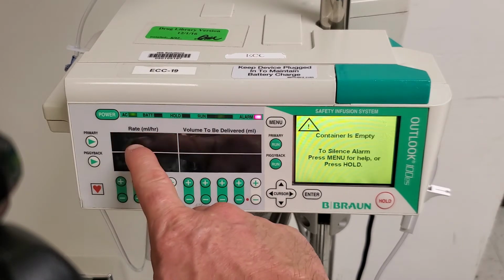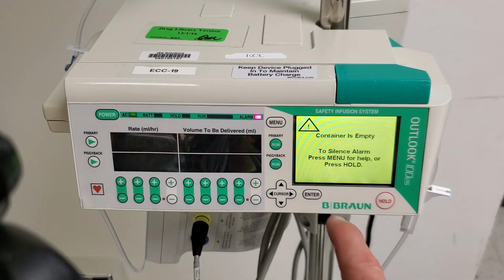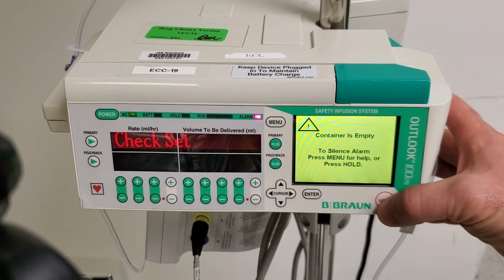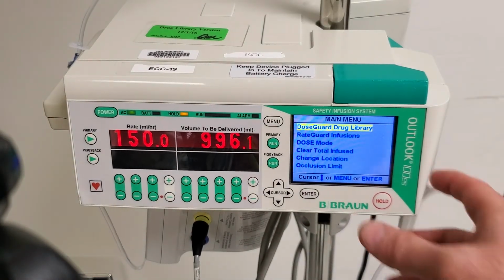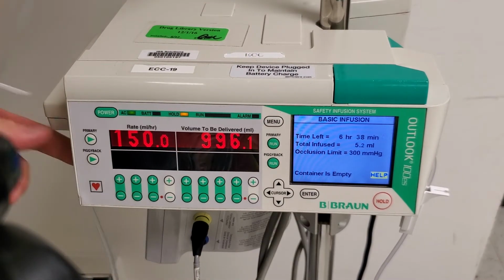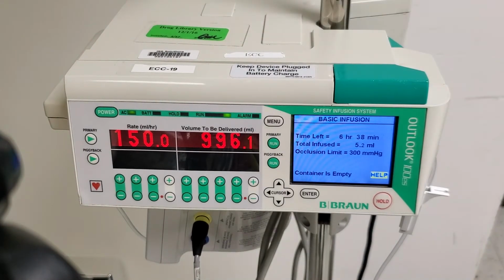Obviously, the faster your rate, the faster the pump will alarm. So to silence the alarm, you see it says check set. We hit hold. We troubleshoot, tells us to check our fluid, check our clamps, and then try to run it again. Now our pump is running.